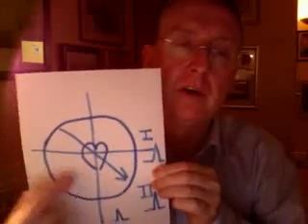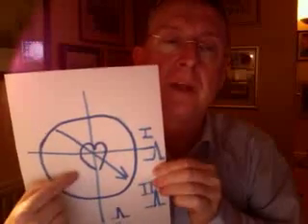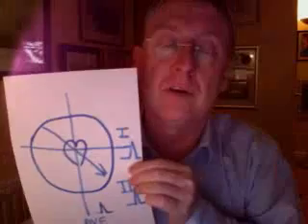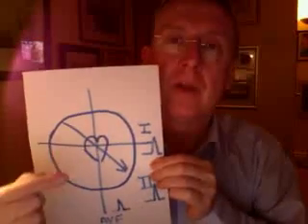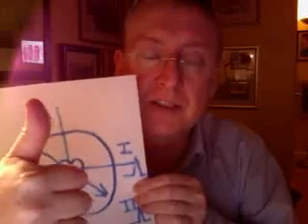Now, because lead 1 and AVF are close enough to lead 2, they will portray the impulse coming kind of towards it as positive also. So, where the axis is normal, you will get lead 1, an upright complex, lead AVF, an upright complex. If you look at the complexes in lead 1 and lead AVF, and they're both upright, you've got a normal axis.